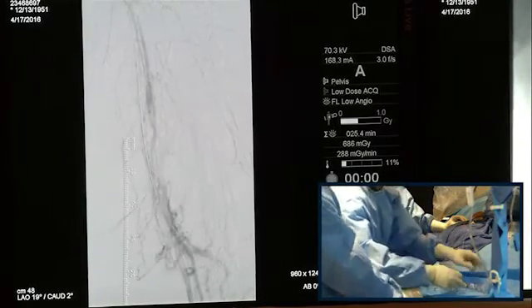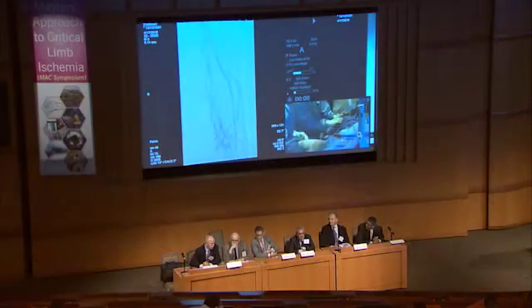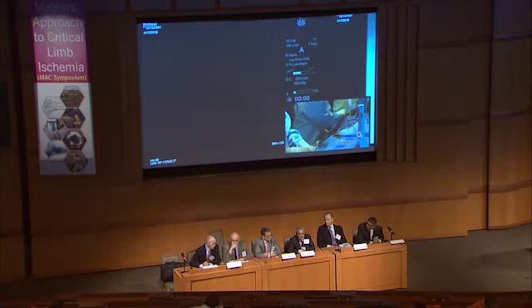I understand what you're trying to say, but Mehdi, I just want to mention, we are still breaking up a little bit, but we get the gist of what you're trying to say, that you do have some flow, you have placed your Viabahn. The question we are asking here of Thomas and Bruce and John is, will they all recommend going after at least one or two of the below-the-knee vessels to improve outflow? So Bruce, you can take that on, and then Thomas and John.